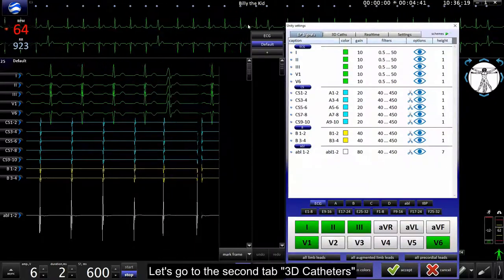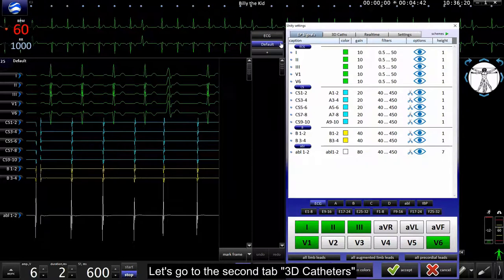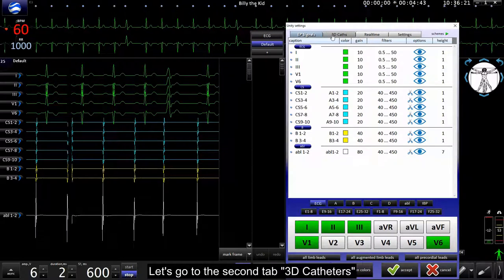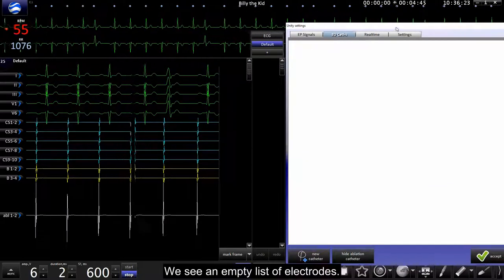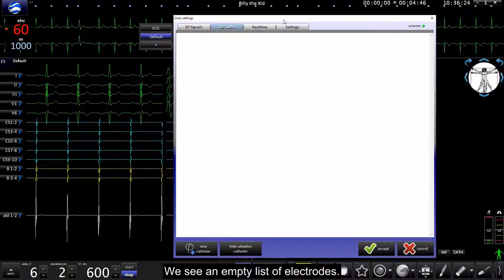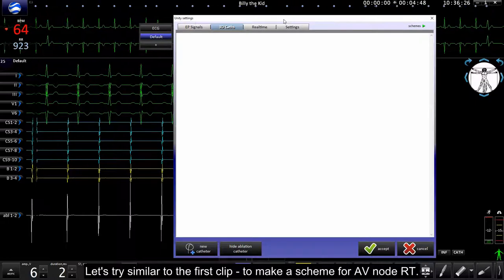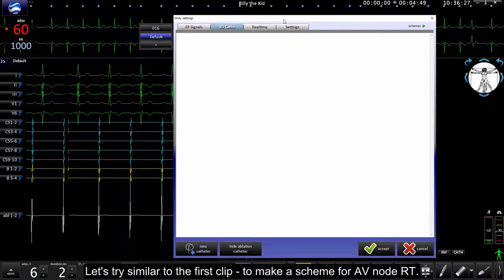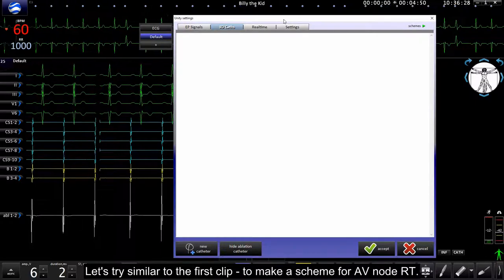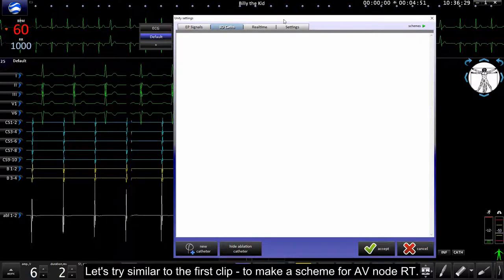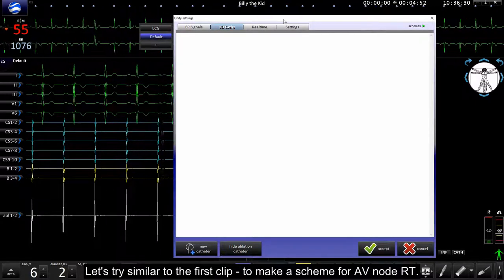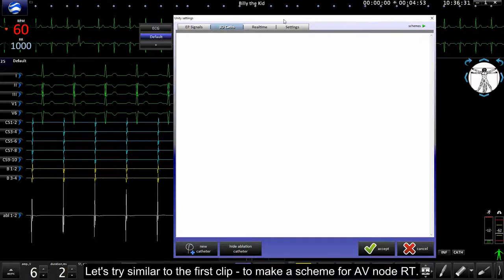Let's go to the second tab, 3D Catheters. We see an empty list of electrodes. Let's try similar to first clip to make a scheme for AV node RT.